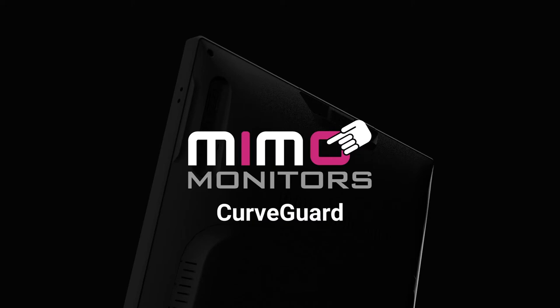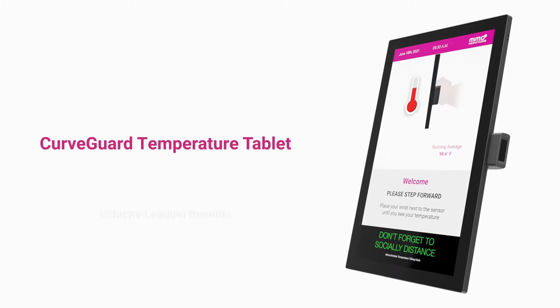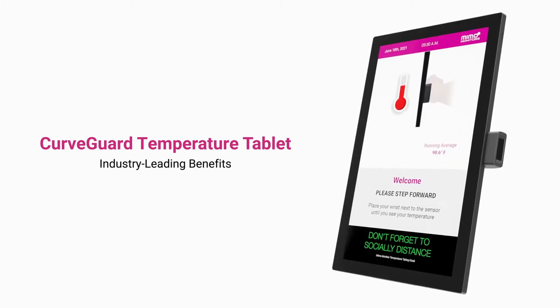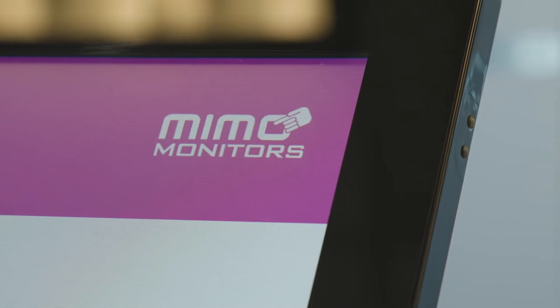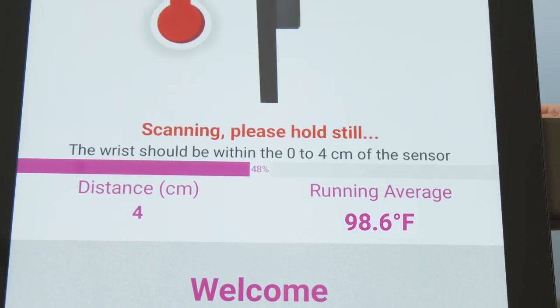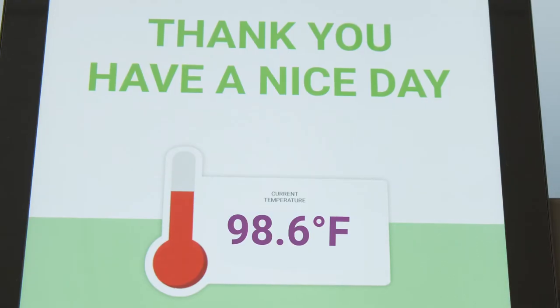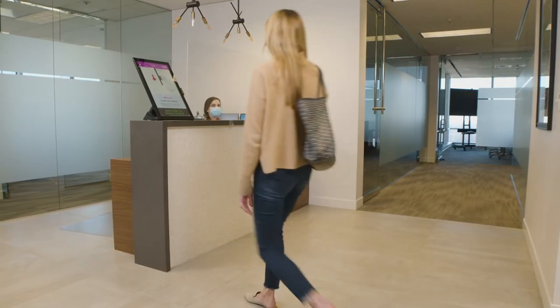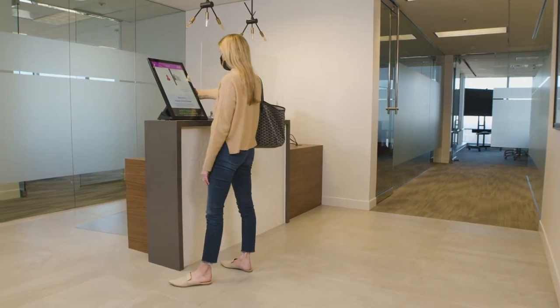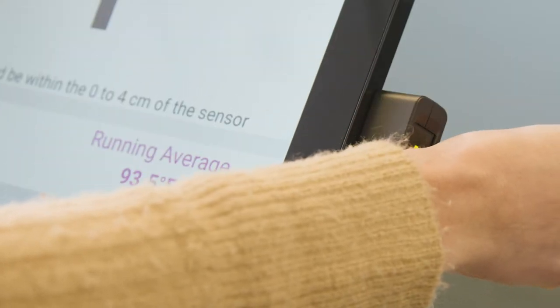The MIMO Monitor's CurveGuard is a simple and accurate temperature-taking solution that provides a variety of industry-leading benefits. Customizable, flexible, and comprehensive, it can be utilized in a myriad of ways to fit your unique needs with a range of available capabilities — from a simple green and red light to stop or enter, to syncing between locations, to remote management and monitoring, and an available full analytics suite. This platform is reliable for accurate results and intuitive for the public to use.